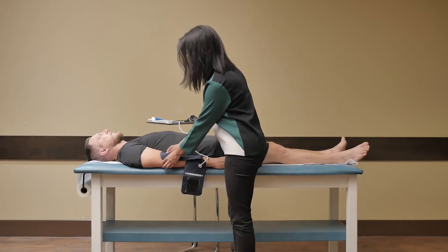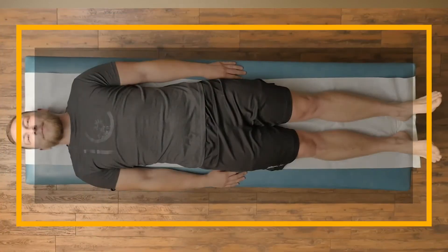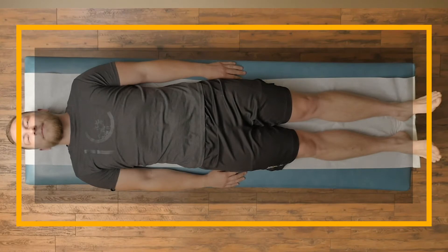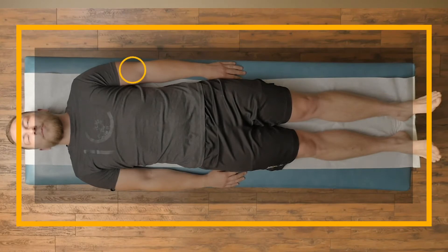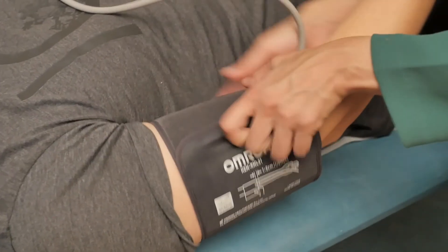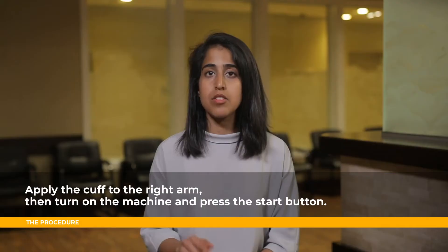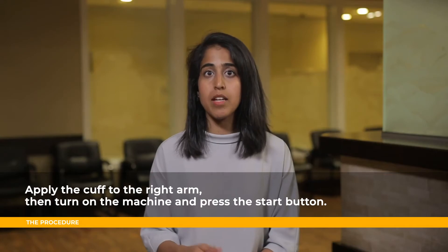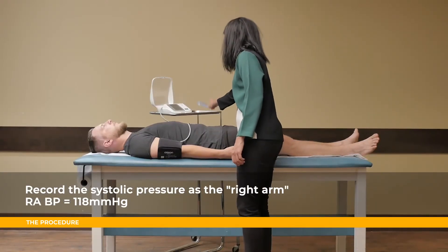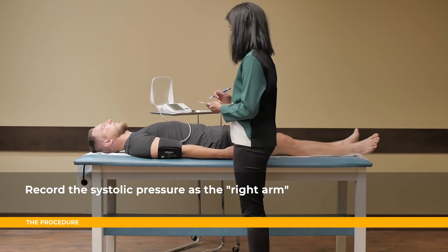The procedure follows a counterclockwise direction, starting at the right arm, then moving to the right leg, left leg, and left arm. Start by applying the cuff to the right arm, then turn on the machine and select the start button to begin measuring the blood pressure.